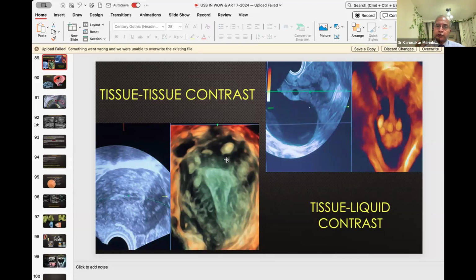Because you're all gynecologists, I want you to know what is dynamic hysteroscopy, what is bimanual ultrasound. Bimanual means you are always using the abdominal hand like you used to do bimanual examination a long time ago. 20, 30 years ago, all professors were teaching how to bring the abdominal structures towards the pelvis for a complete, accurate diagnosis of bimanual examination with hands. Most people don't do that anymore, for whatever reason. So I do highlight that your ability to diagnose myometrial pathologies is enhanced. Second, they have an autoimmune condition. You must rectify that rather than just giving GnRH analog and doing frozen embryo transfer. This is what a lot of people ask me.